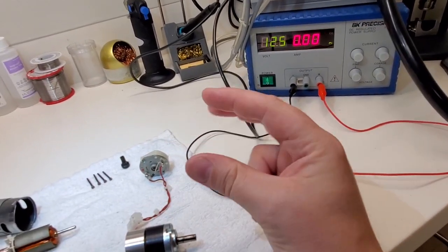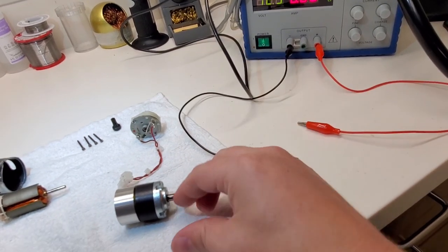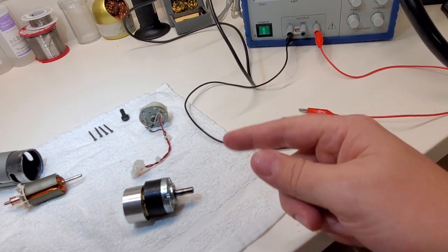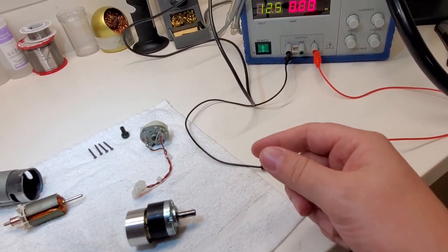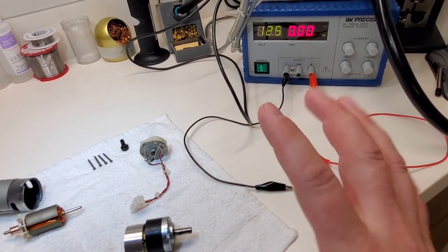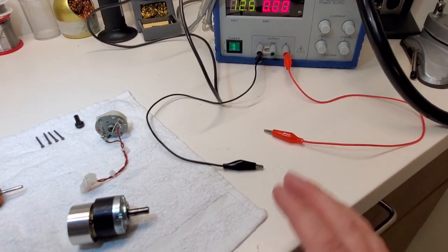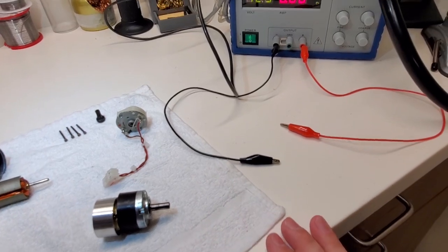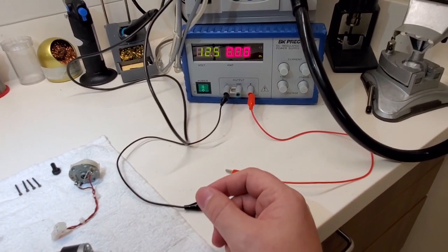Or if you grab onto the wheel at the beginning, your output shaft, when you grab onto it and you start to spin it, it will then maybe start spinning slowly on its own because you broke that initial inertia. But that didn't happen. This one here, it was just non-existent. There's no resistance on the wheel.